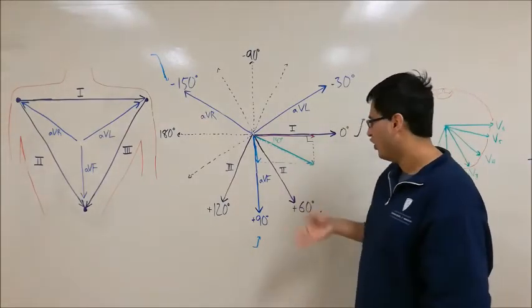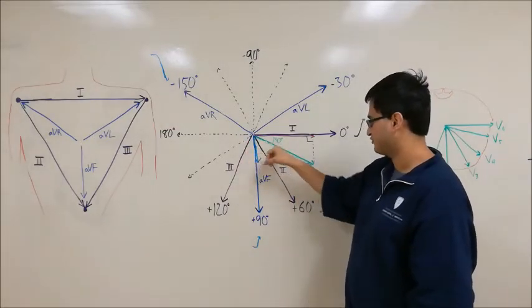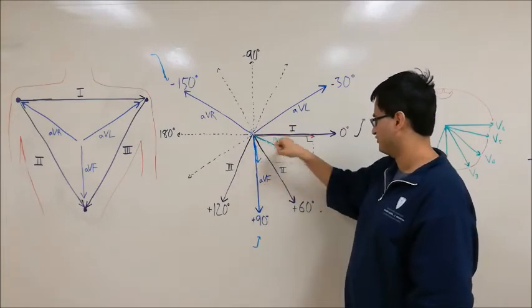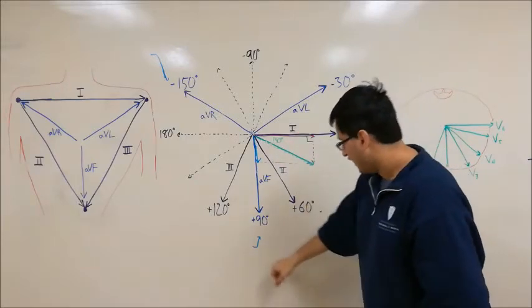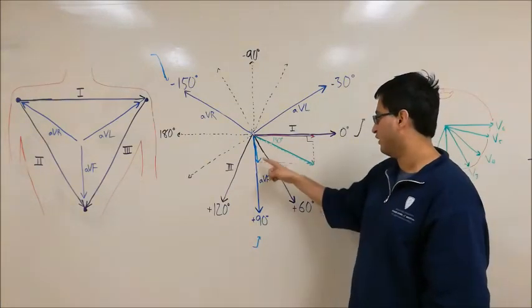Now a similar thing, we need to break up this into its component vectors. And this is the component vector of this green vector in the downwards direction. Now note how this vector is shorter than this vector, right? Because 30 degrees is a lot closer to this line than to that line. Because of that, the recording on AVF will be shorter but still positive, because this component is shorter than that component.